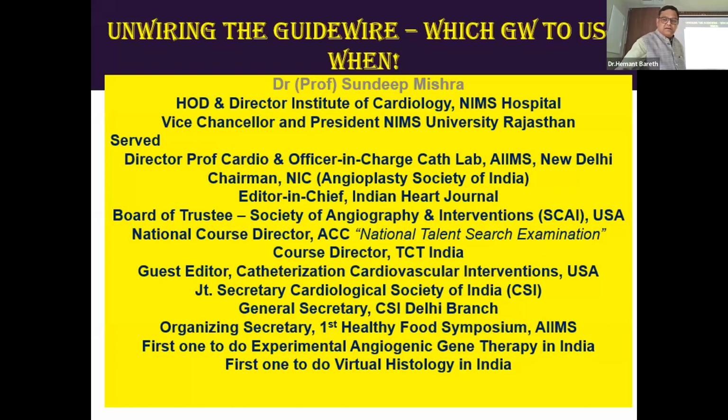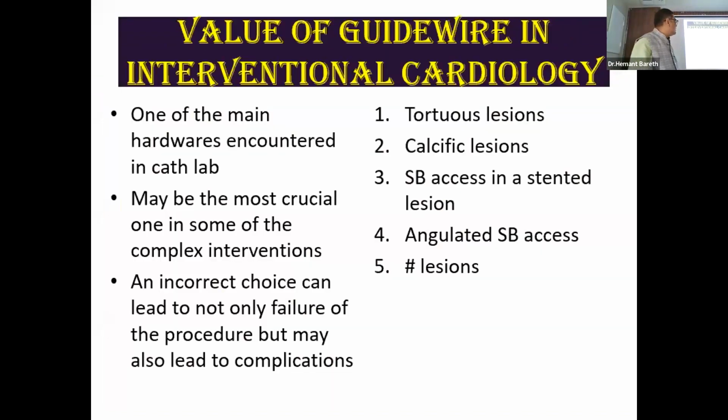I think we'll start. So today we are going to discuss unwrapping the guide wire, which guide wire to use when. So what is the value of guide wire in interventional cardiology?